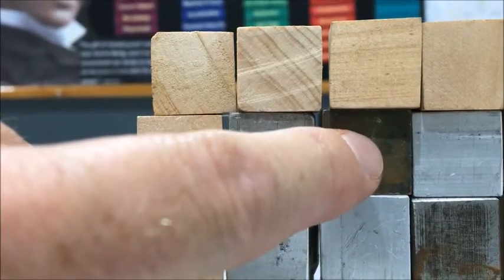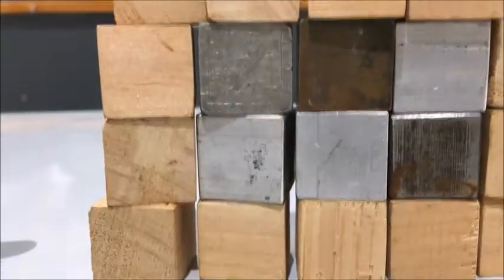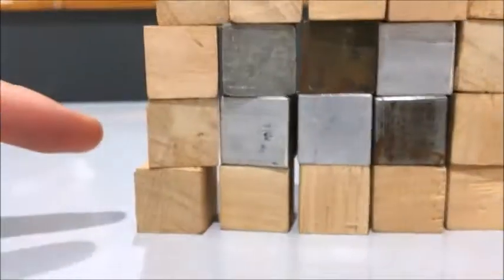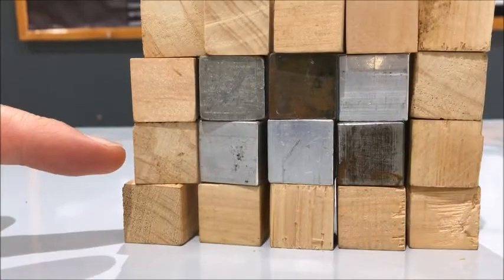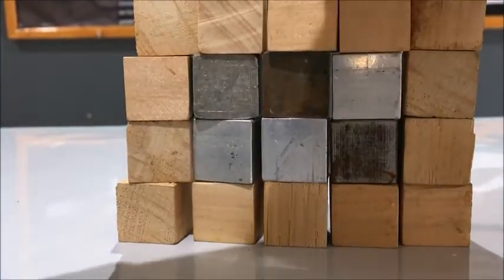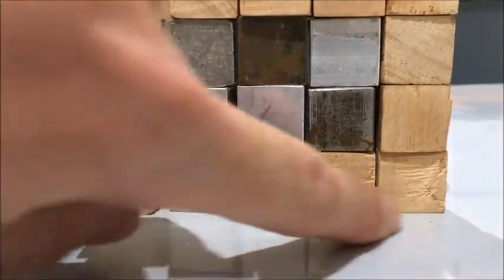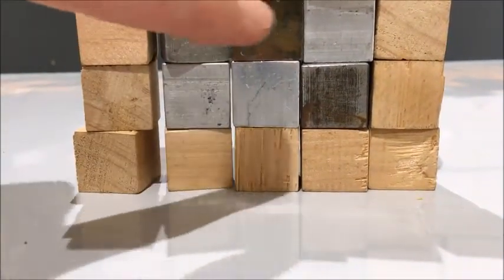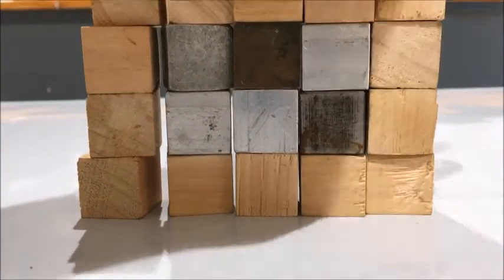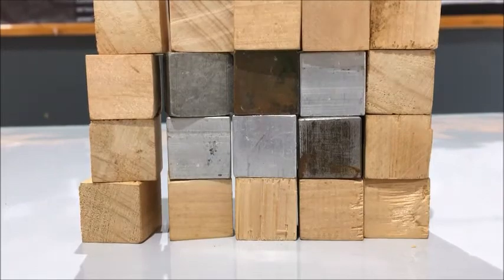And if I went even further up, I put a different material here. Maybe that's an especially dense area of bone. So I'm just going to give it a number for the sake of it. If there were a value of, let's say, a power of 10, I'm not going to say what units, of intensity of X-rays, so joules per meter squared or whatever, then I would expect more joules per meter squared to come out of this one here than here, because the flesh is not as absorbent as the bone is. And this layer here is going to be even less, because this one here perhaps is extra absorbent, made out of a different material. So that's the general idea.